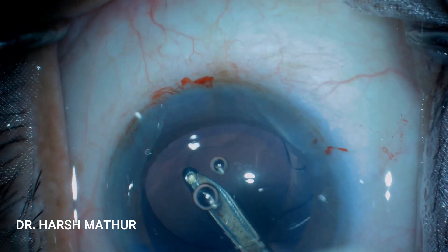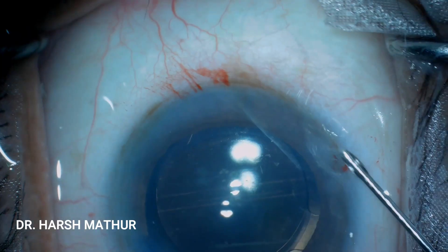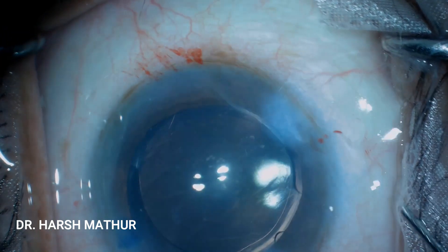Do let me know your experience about the opposite clear corneal incisions. Which procedure do you prefer most — LRIs, OCCI, or Toric IOLs?